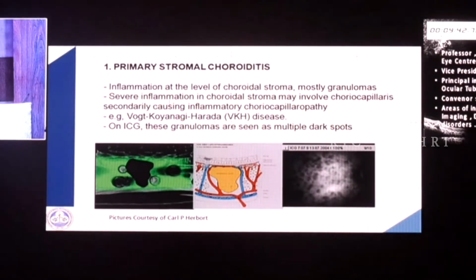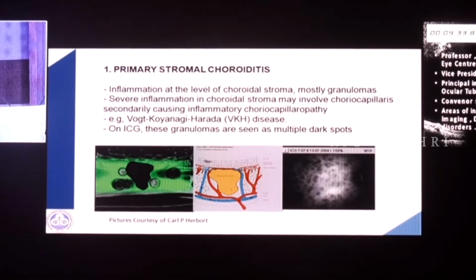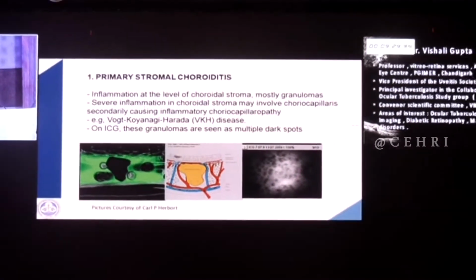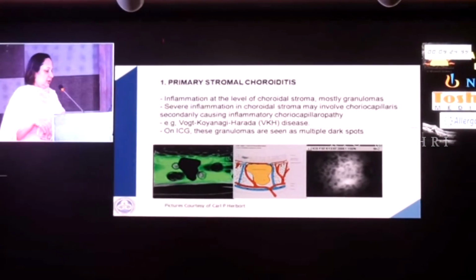We'll be talking about choriocapillaris and how OCT angio helps us. So let's get back to very, very basic stuff. When we talk of choriocapillary ischemia or choriocapillaris inflammation, it could be of two types.